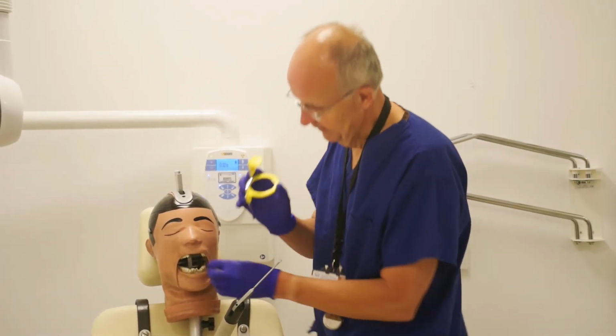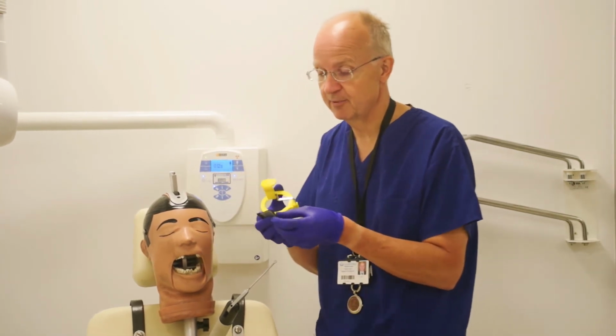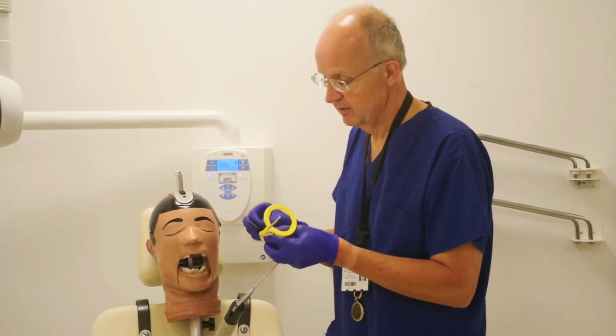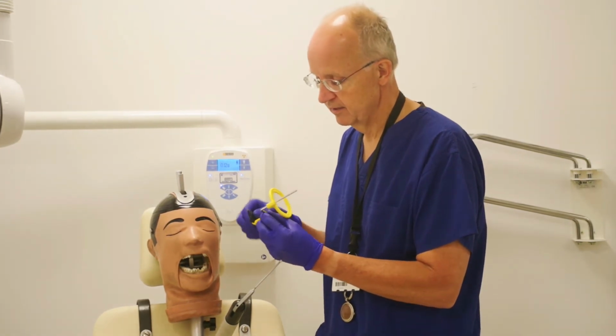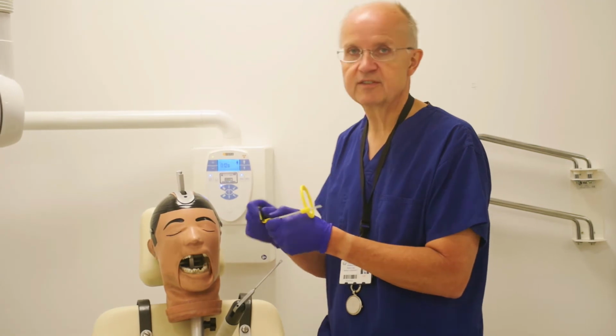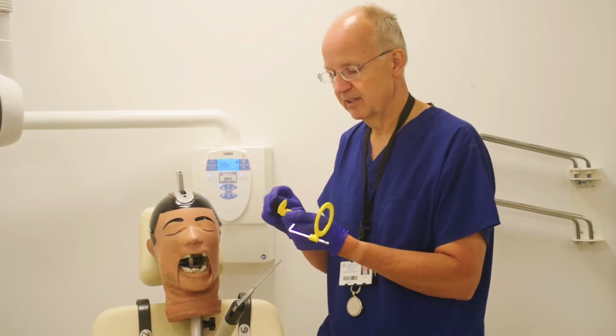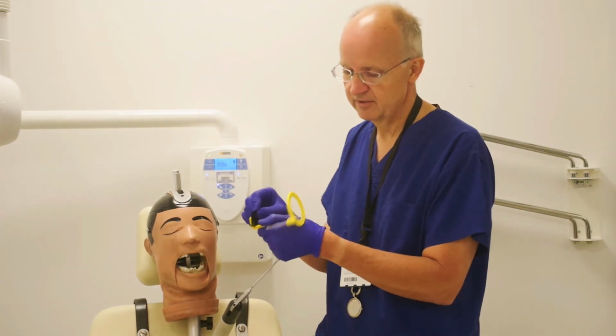Oh, now then. What's happened there? The film has dropped off. Now that sometimes happens, and that's why you need to be really, really careful when you put these films in, to make sure that they're nice and tight in the holder. What you find over time is that because these get autoclaved, the plastic gets a little bit worn, and particularly these very thin phosphor plates have a tendency to move around.